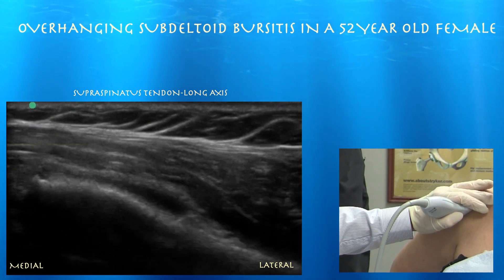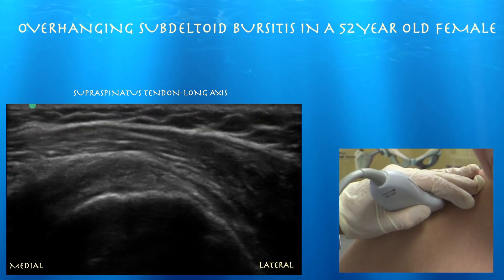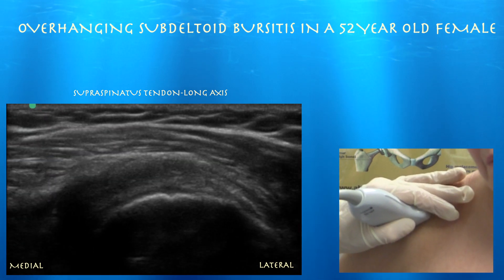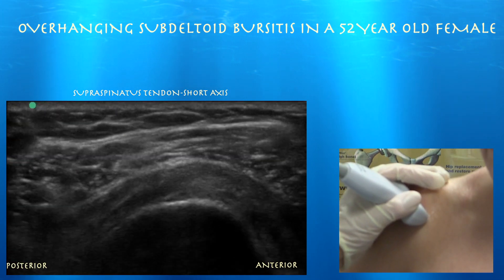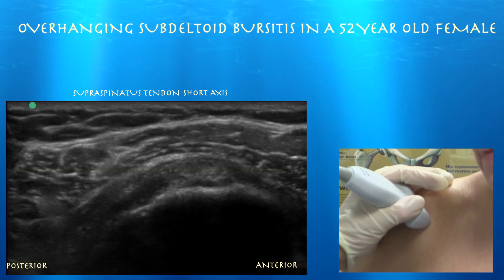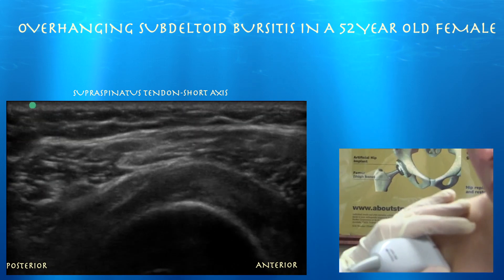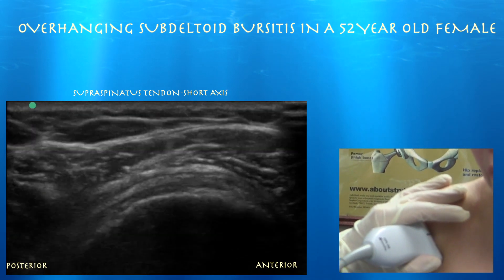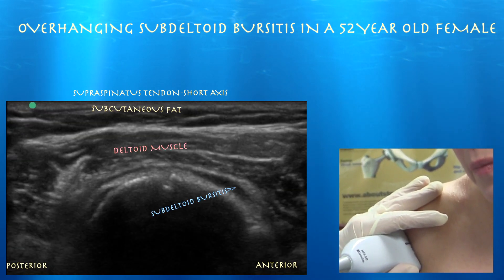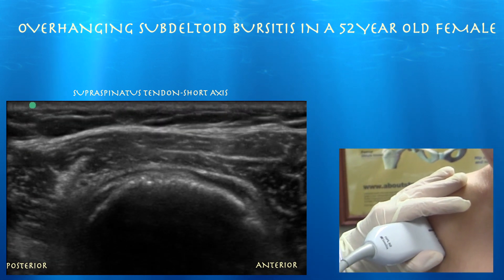She does have some overhanging subdeltoid bursitis. It's interesting how far the subdeltoid bursa can extend. We can see what appears to be a rotator cable within the rotator cuff. Here's the supraspinatus tendon in short axis. In short axis you can see the biceps tendon, which is the anterior margin of the supraspinatus tendon — the left side of the screen is posterior. You can see some subdeltoid bursitis here, which is quite apparent.